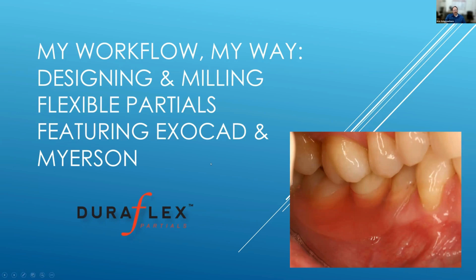Also, it doesn't absorb moisture, or almost zero moisture. So when the doctor delivers this to a patient, it's not going to get stained and look gross over a short period of time, which nylons can do, because nylons are hygroscopic, which means not only do they allow moisture in, but they will actually pull it in. So all in all, it's a better material, and it's really suited nicely to milling.